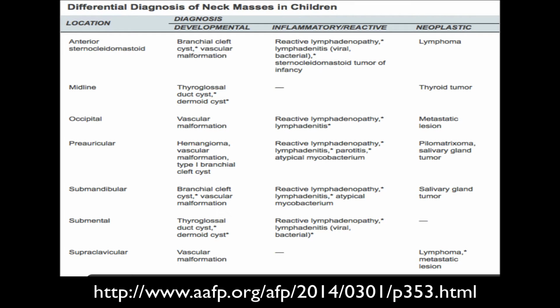Overall, the patient looked pretty well. Now, it was relatively large, it was unilateral, but it did not appear as a typical lymph node would, as a typical simple cyst might, and they weren't sure exactly what this diagnosis was. Here's what the ultrasound showed.